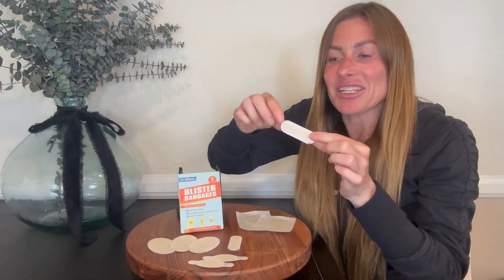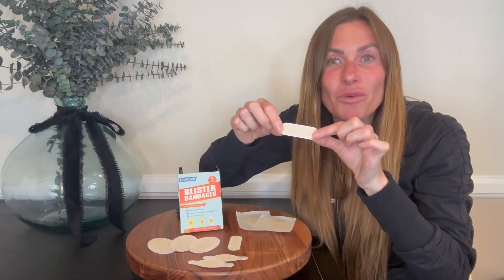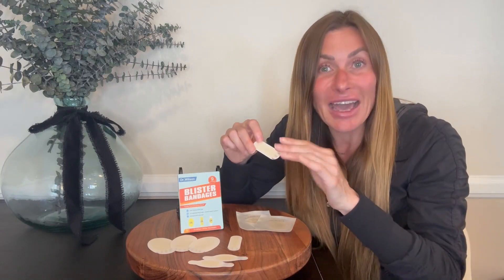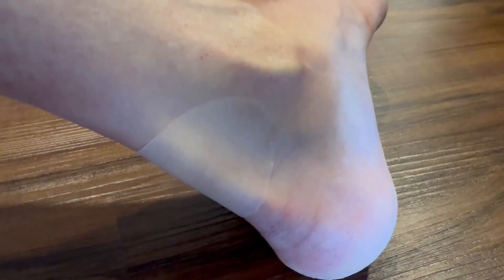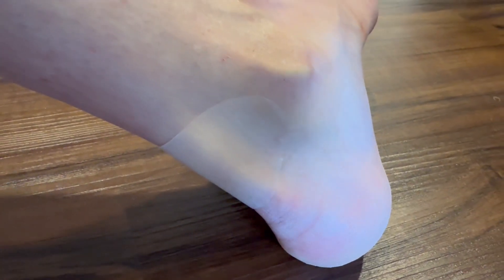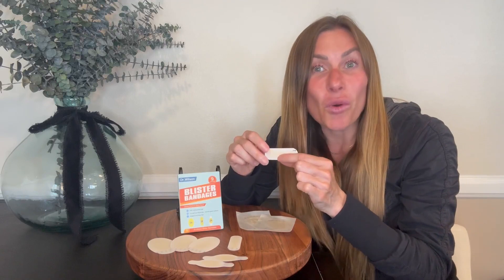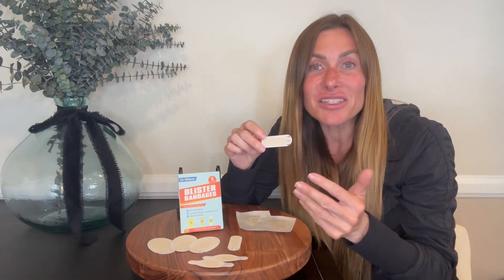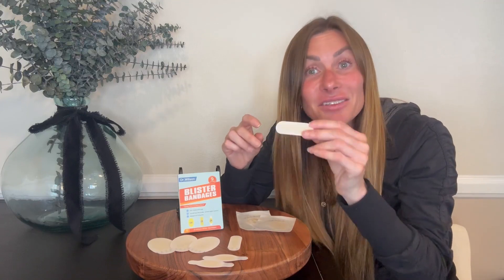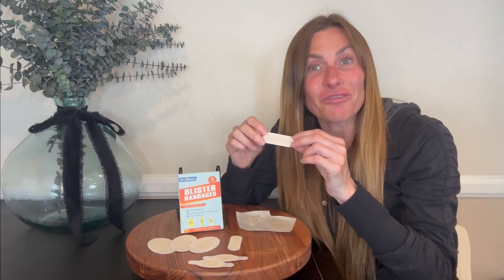These bandages have tapered edges which allow the bandage to lie flush and flat with your skin, and therefore prevents any rolling or peeling up on the sides of the bandage. The bandage is also designed to absorb the liquid from your blister if it begins to ooze out, and still stay sticky on your foot.